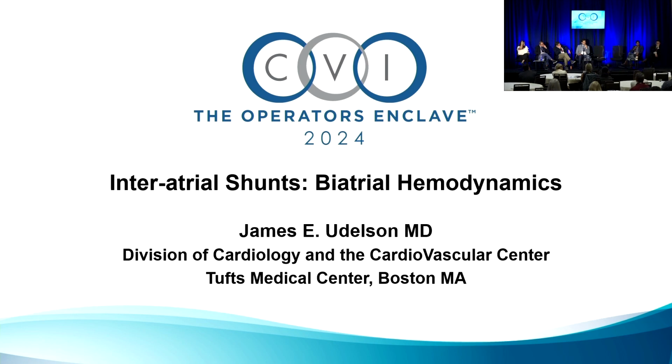Absolutely, and I think you start off thinking very simply, and at first there was a lot of discussion about the size of the shunt, bigger, better, smaller, the V wave is 5, this is 7, Occlutech was 8 or 10, but it turns out that's only one little piece of the equation. It's the pressure, it's the compliance. This is really complex hemodynamics.